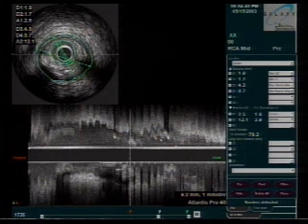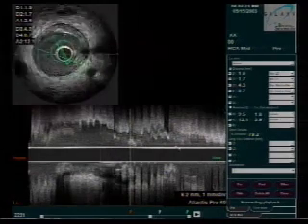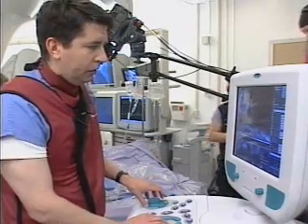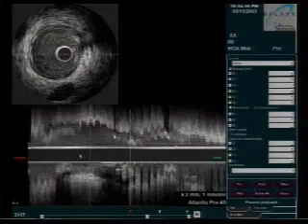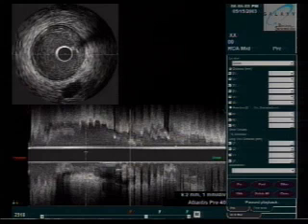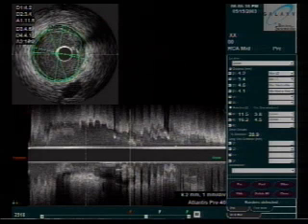We're going to save these. I'm going to make a couple more measurements, proximal and distal to the artery. I've now moved the camera proximally. If we look on the bottom of the screen, we've now laid out the artery from distal on the right to proximal on the left, and I've moved the camera, the white line here that I can move with my cursor, up to an area where that band of atherosclerosis has now disappeared. And now we can once again make some quick measurements, and we see that proximally the artery is again about 4 millimeters in diameter.